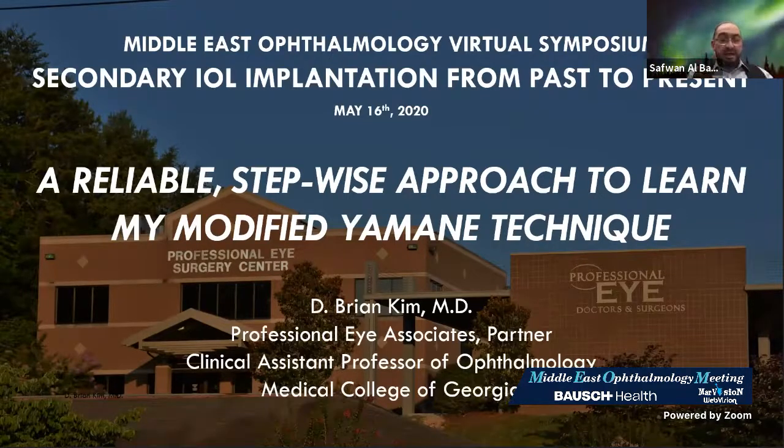As a vitreoretinal and anterior segment surgeon, I went in and saw it: it's not touching, it's in the middle of the vitreous. The issue is that it reduces the tension of the haptics and gives you more space to work with the trailing haptic.